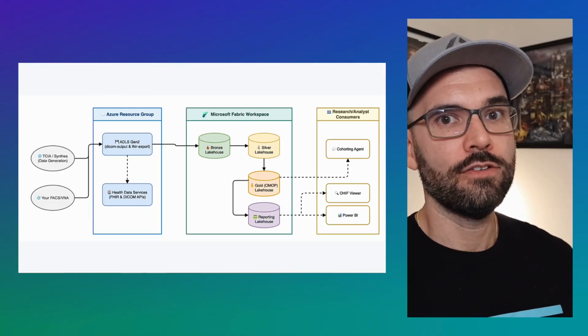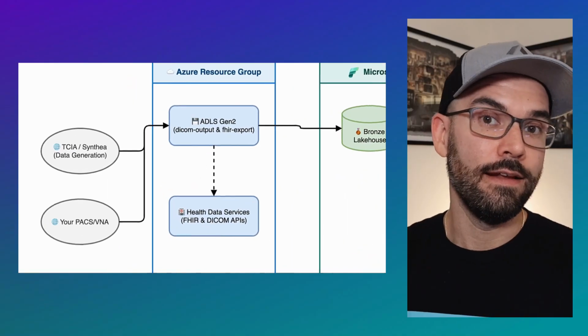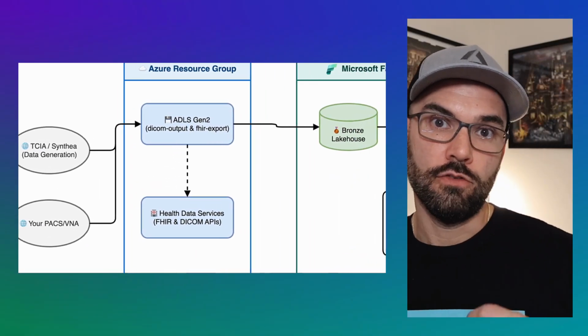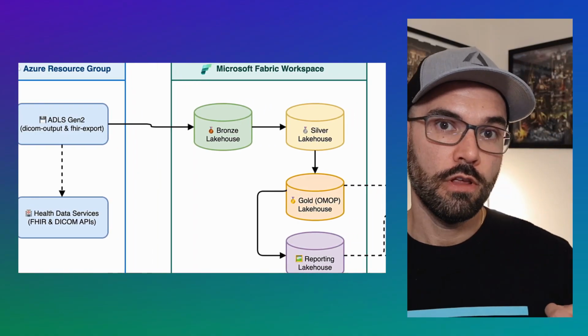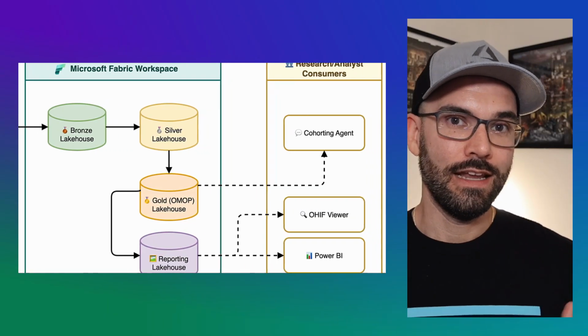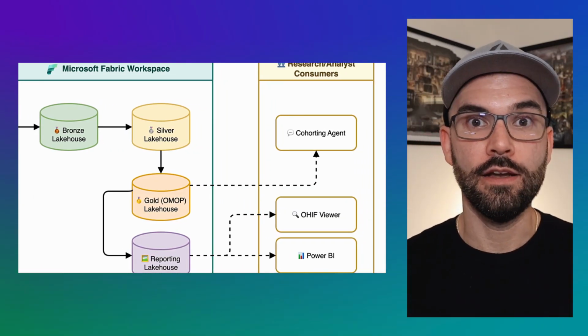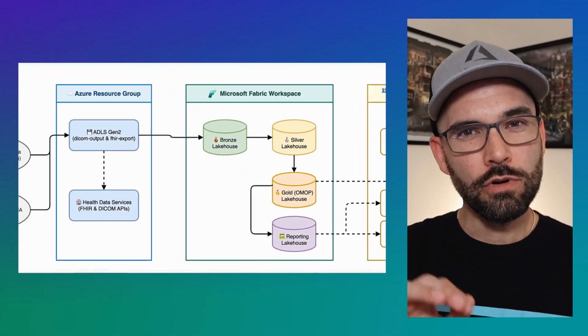And in radiology, typically the technology is not really the bottleneck. It's the context. Where are those images? Are they locked behind a PACS system? Or are they locked behind a vendor-neutral archive, a VNA? And if they are, do I have to use a proprietary protocol that's vendor-specific? And if I can use the generalized protocol DICOM or DICOMweb, can I use it in a robust manner to find patients that have similar images together? And that's what we're going to talk about today.